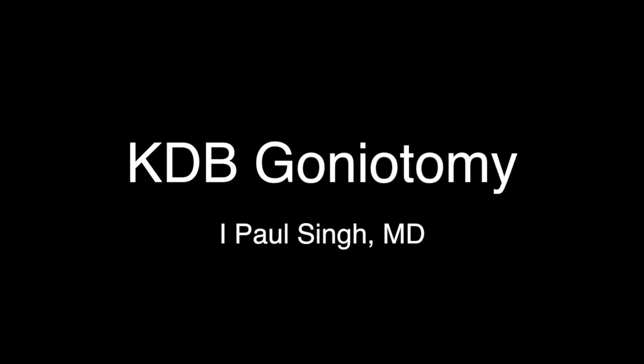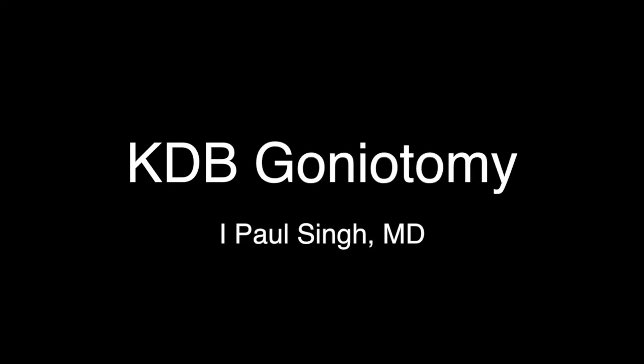Hi, this is Dr. Paul Singh sharing a video of Cahook Dual Blade Goniotomy. The key with any MIGS devices or procedure is to have a great view of the angle.